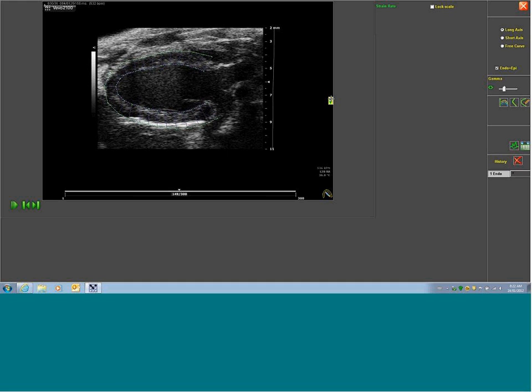As I increase it, they've increased, and I can decrease those as well. Now, I also have the freedom of moving points individually. So if I want an even more accurate trace, I can take those points by left-clicking over each point and adjusting those to follow the trace more accurately to what I feel is a better trace. So if I'm happy with where I've placed my points, then I can hit the analysis tool.